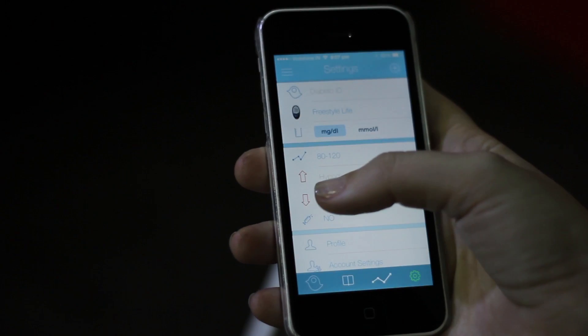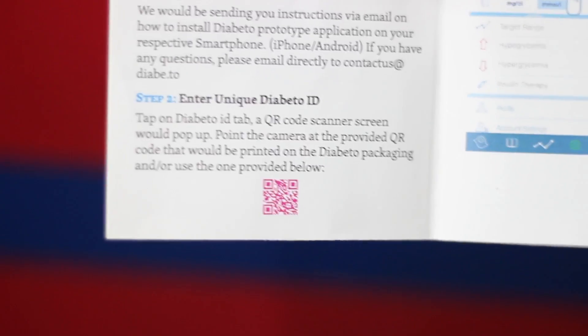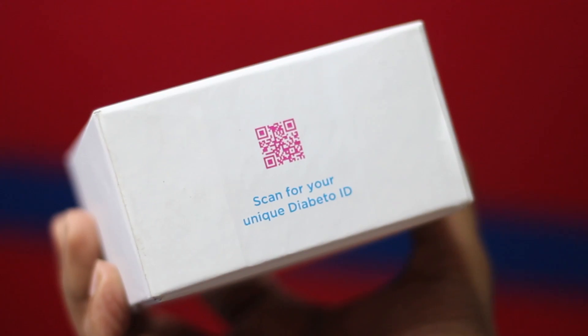So you're going to open your app and we're going to change the settings. Make sure you have your Diabeto ID, which is a unique code either in your user manual or the box.